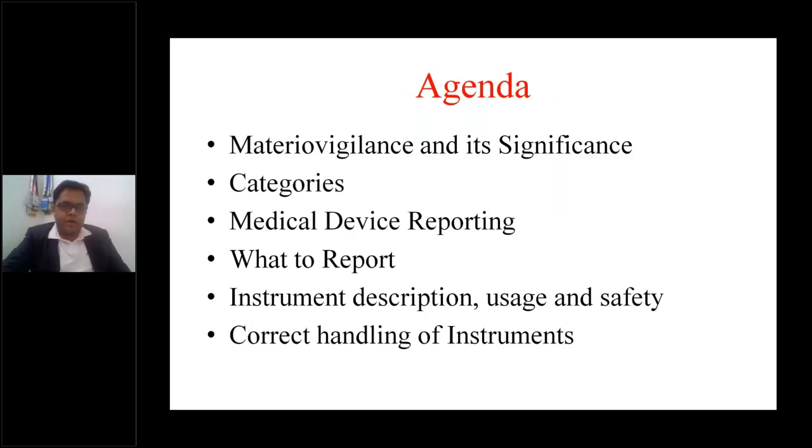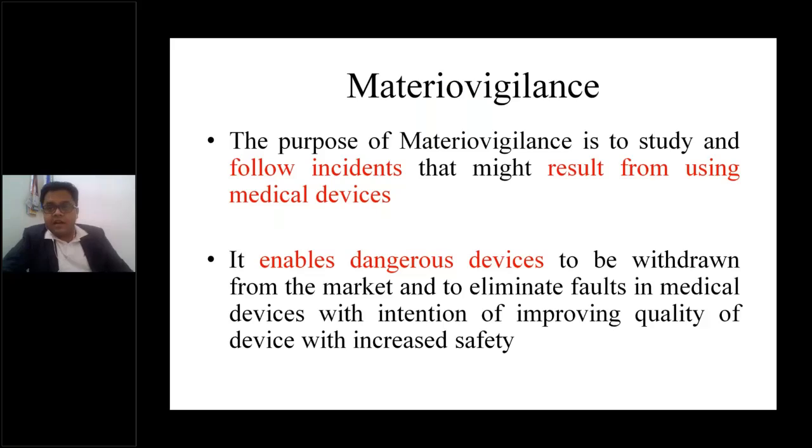Okay, coming to the topic. Our agenda for today would be materiovigilance and its significance, categories, medical device reporting, what exactly is to be reported by a particular surgeon or an orthopedic surgeon, instrument description, usage and safety, and correct handling of the instruments. So what exactly is materiovigilance?